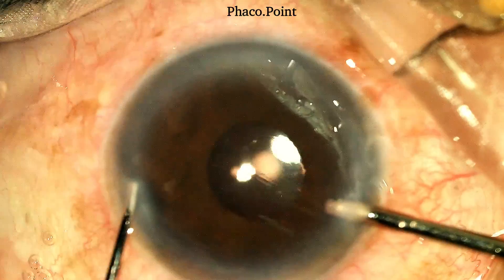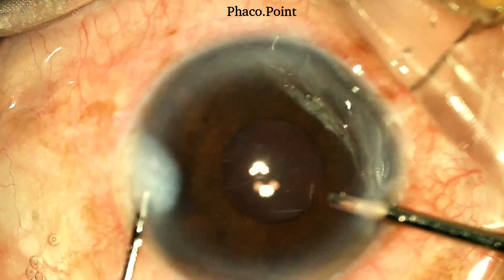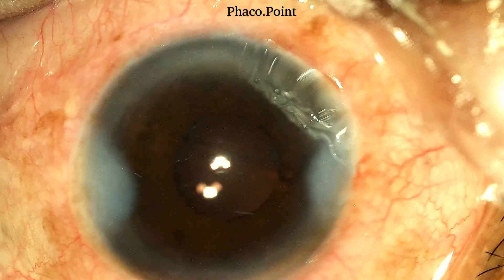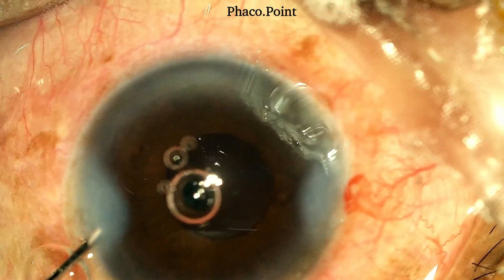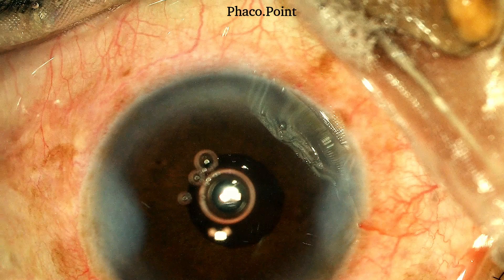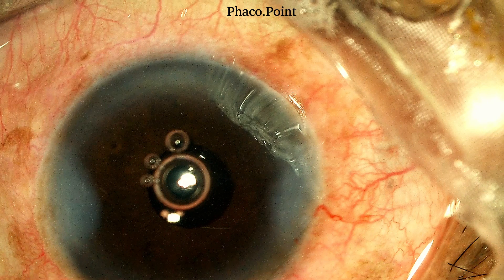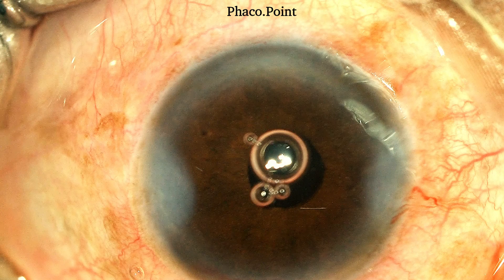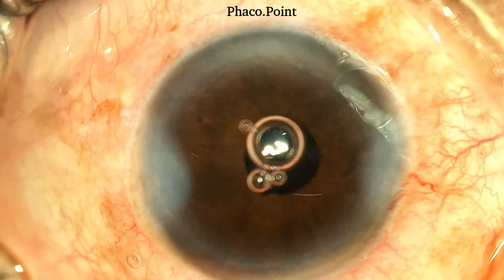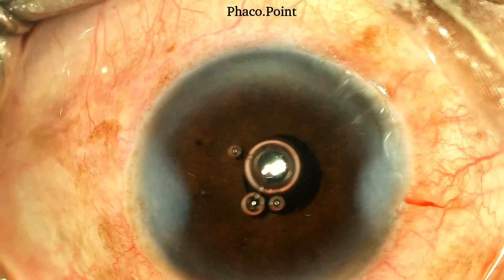Having efficiently cut the vitreous strand, I now proceed to hydrating first the left and then, after removal of the irrigation, the right paracentesis incision. I then inject some intracameral pilocarpine and watch how the pupil starts to go down, giving me the confidence that there are no residual strands of vitreous. I then wash out the intracameral pilocarpine and finally inject some intracameral moxifloxacin into the eye.